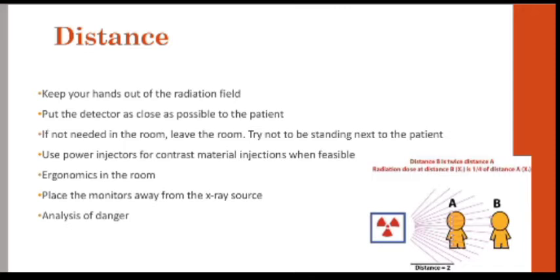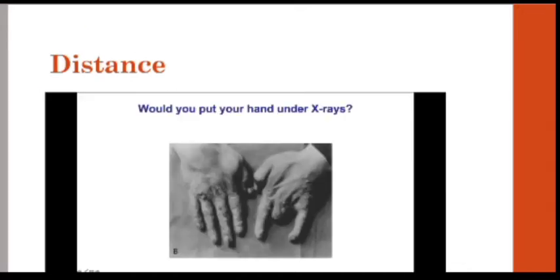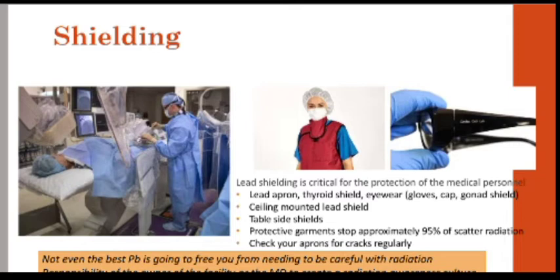Ergonomics in the room: place the monitors away from the X-ray source. Analysis of danger is essential. Would you put your hand under X-rays? The distance is important.